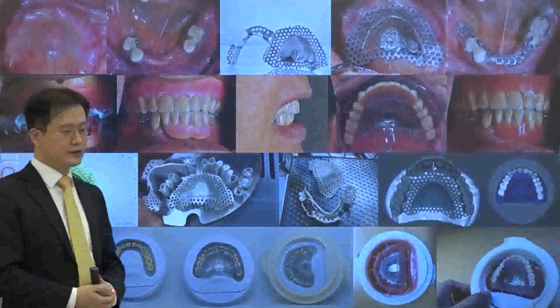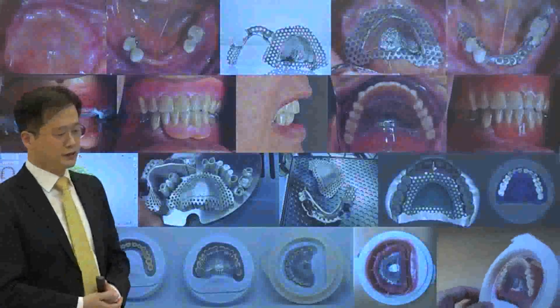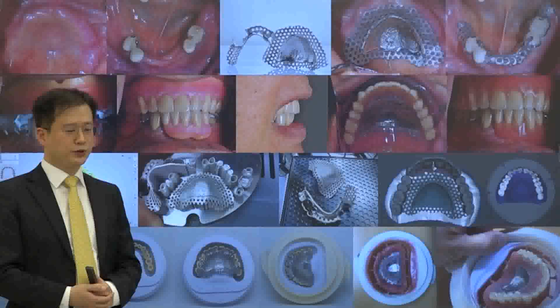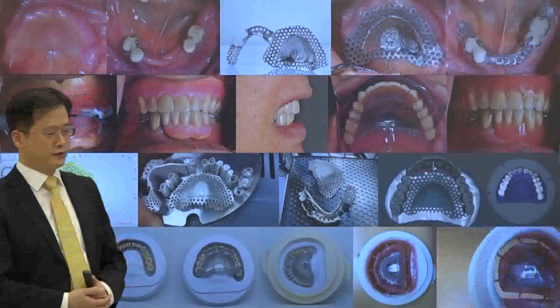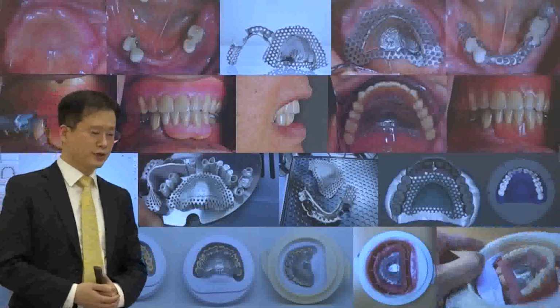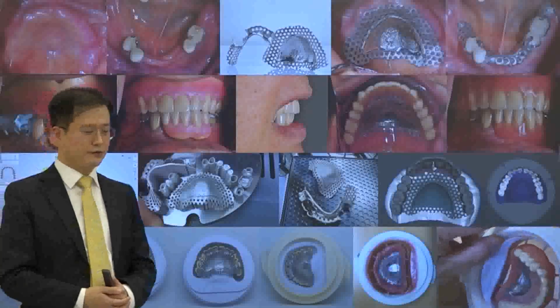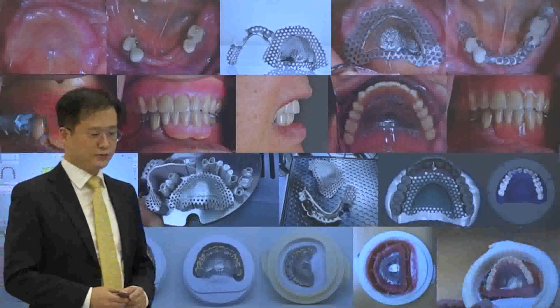In South Korea, it is necessary to make a metal framework embedded denture with a heat curing resin in order to receive national health insurance. I'm developing digital denture manufacturing technology for this unique environment at my hospital.